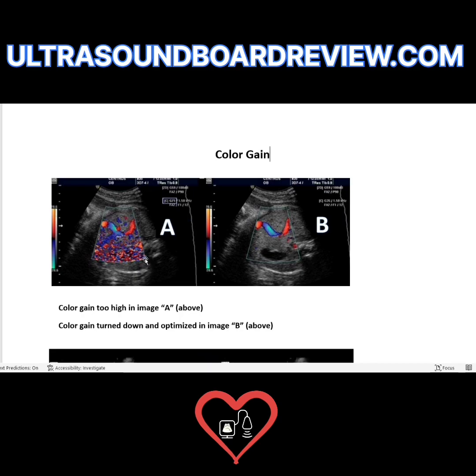Your color box can be filled with color speckle or confetti. If you get a question asking how to get rid of color confetti, think: confetti is related to color gain. Turn down your color gain to fix it — the gain is too high here.